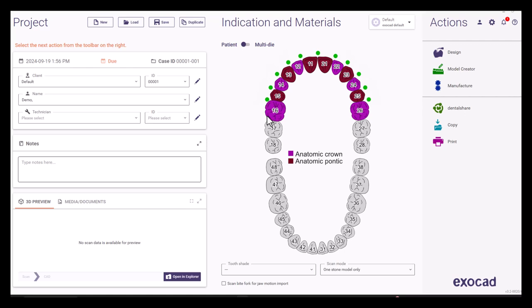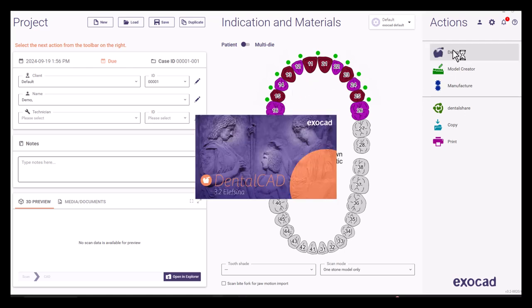Once prescription in ExoCAD is appropriately filled, we can proceed to the design stage.